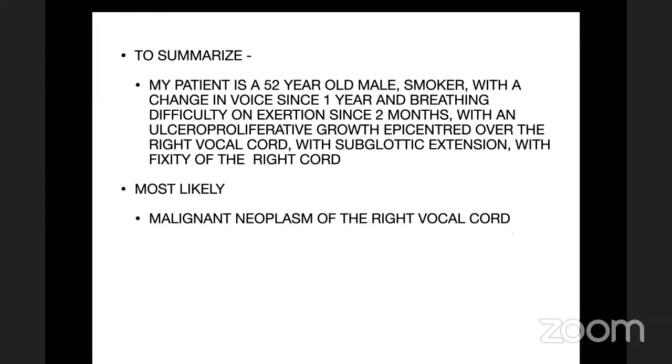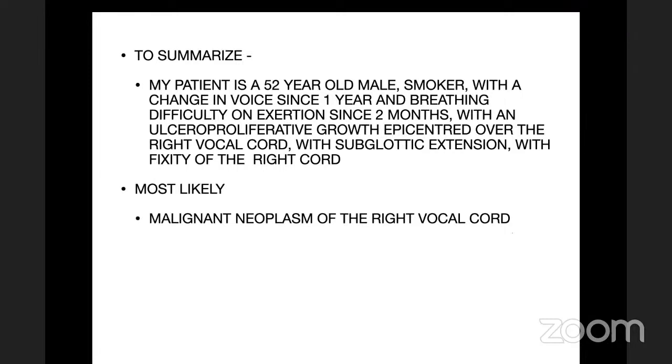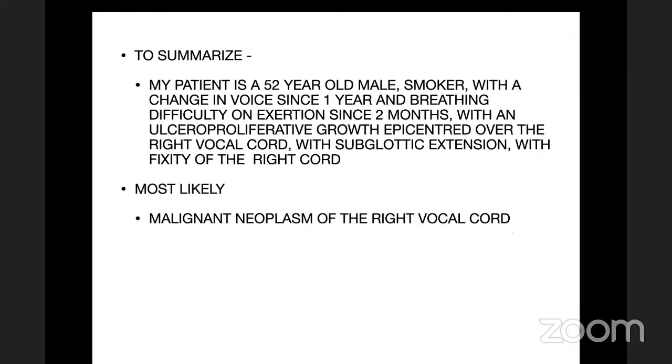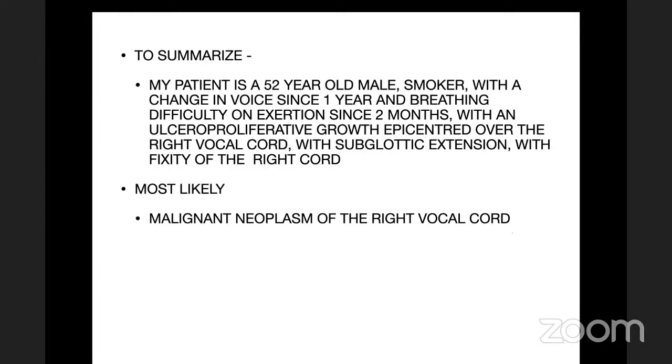Explain what's the importance and why does this happen? It is because of the signature shape of the cricoid cartilage. Okay, good. And what's the importance when making choice of treatment? Patients with subglottic extension of the tumor are not suitable candidates for organ conservation surgery. Listen, I'm asking about 1 and 0.5.